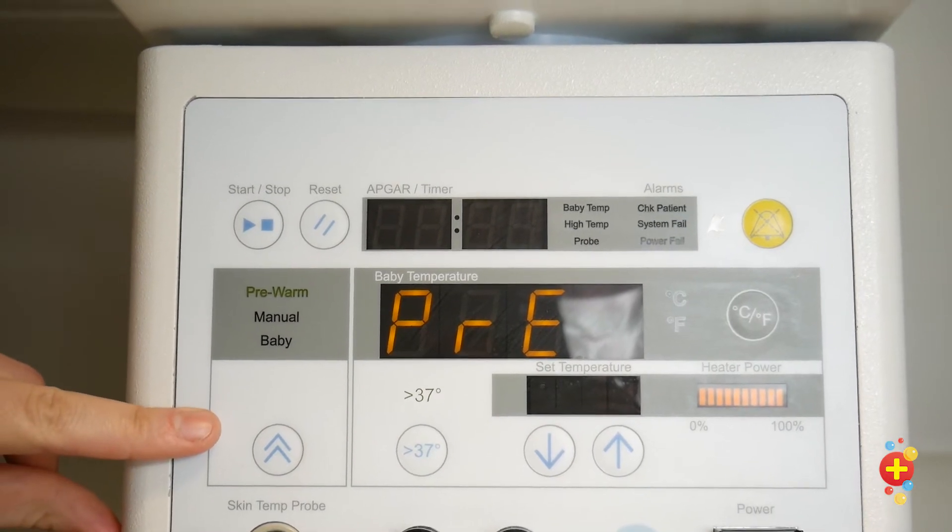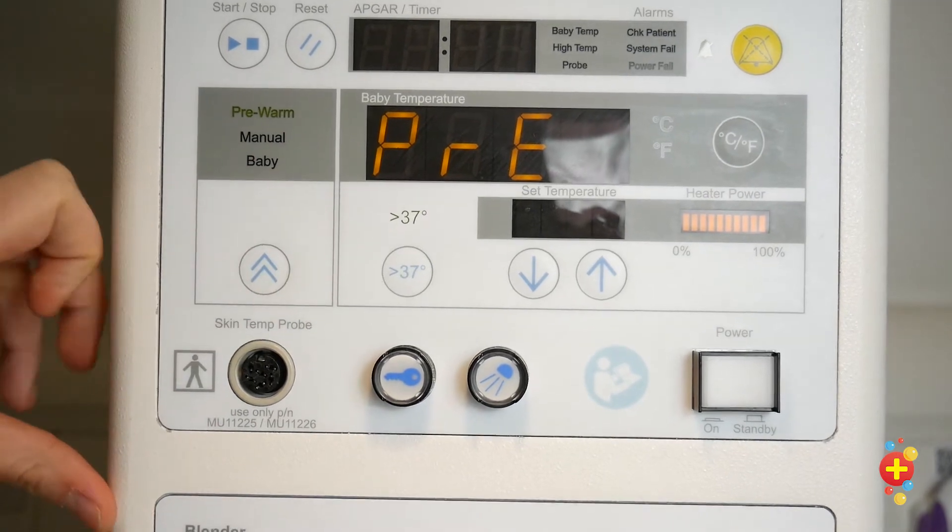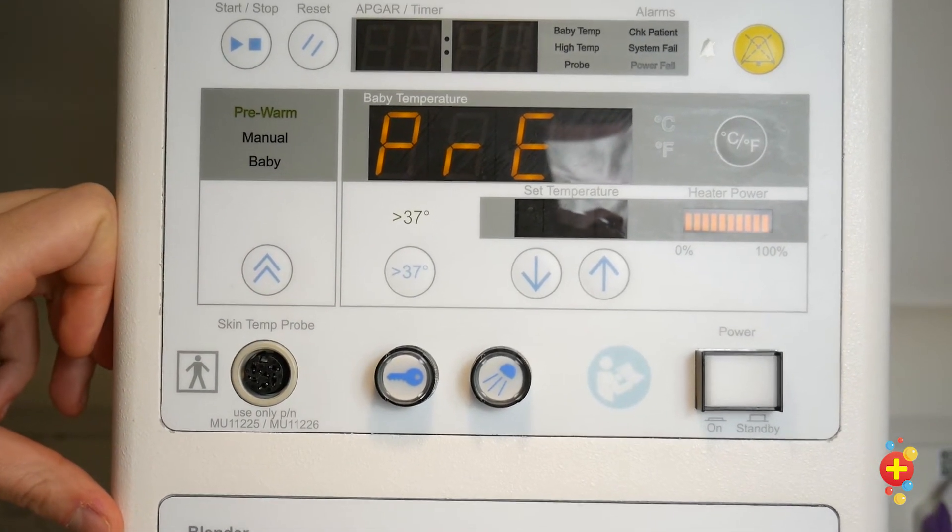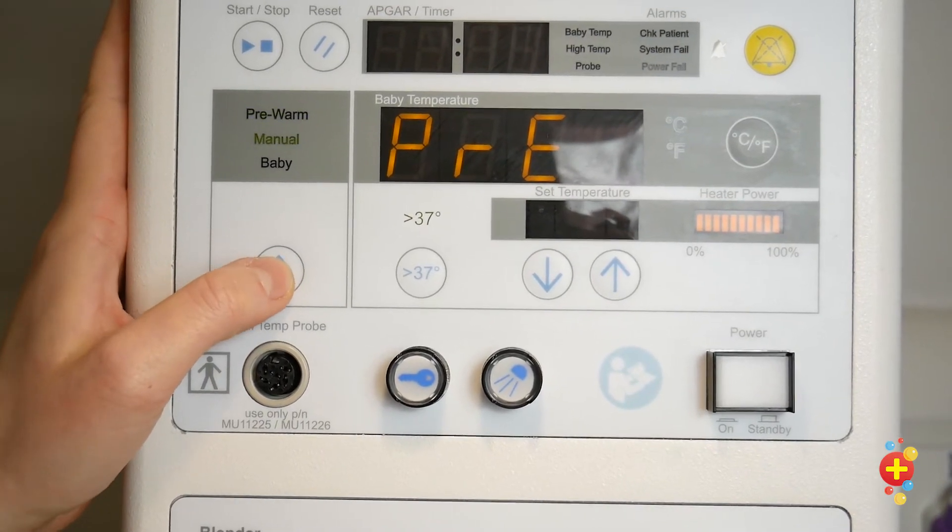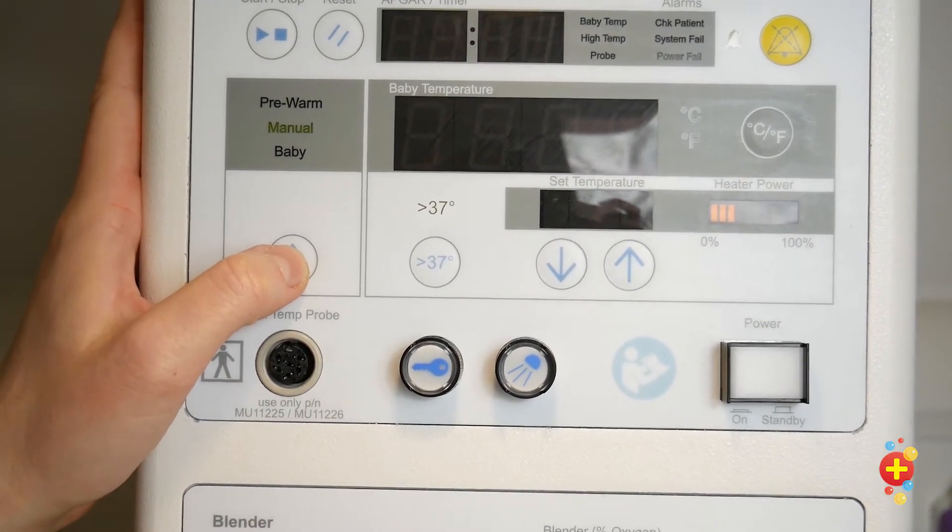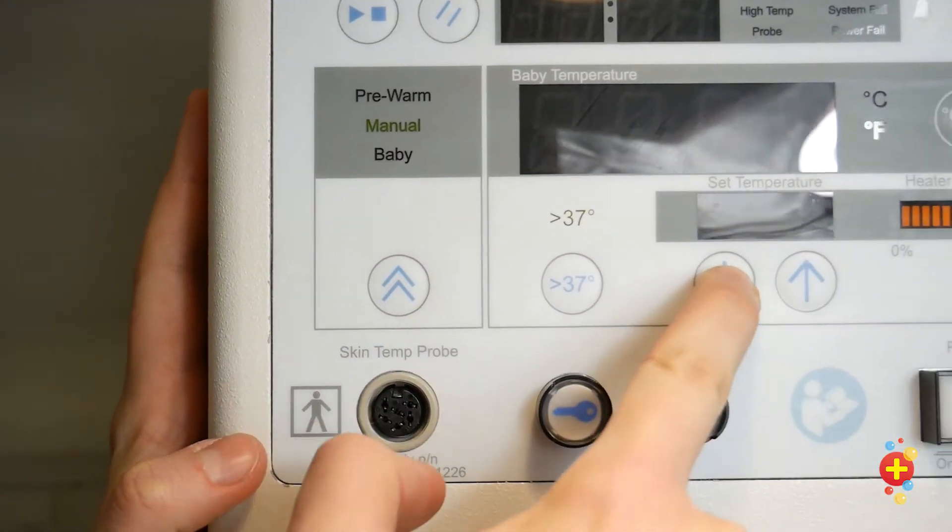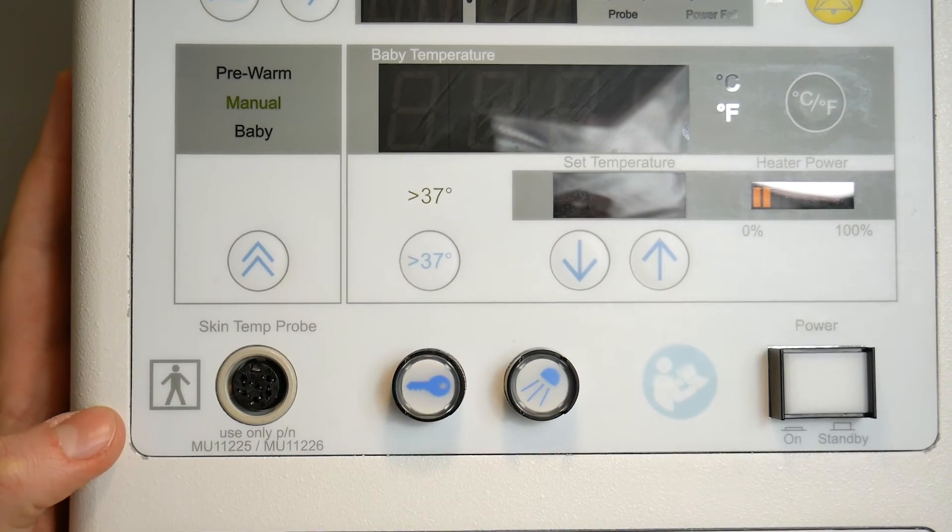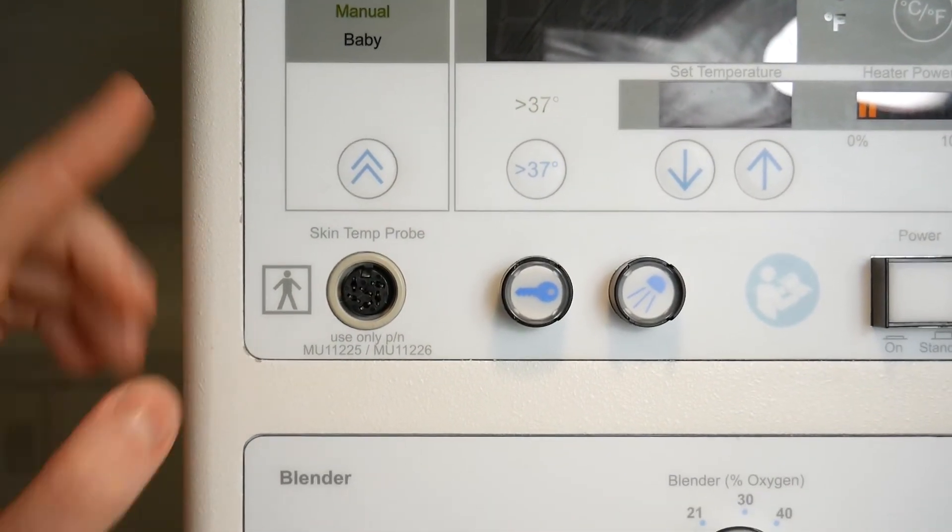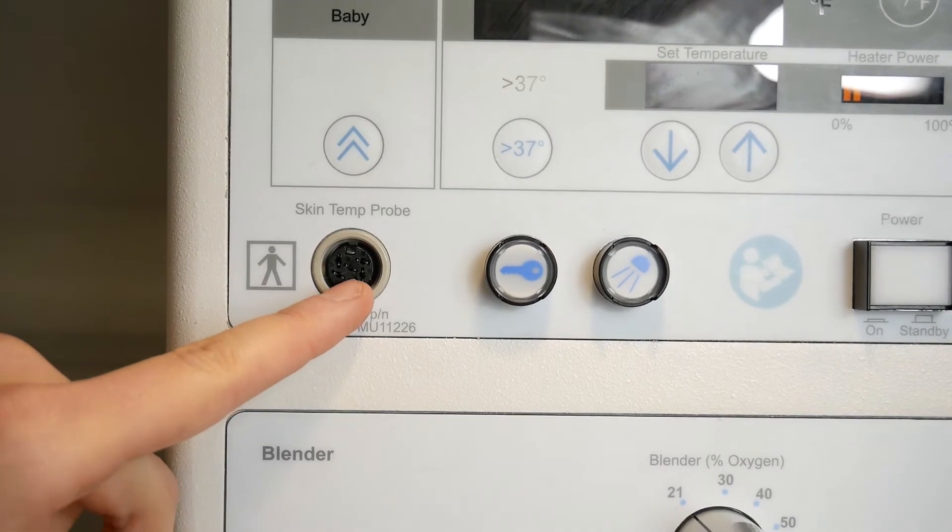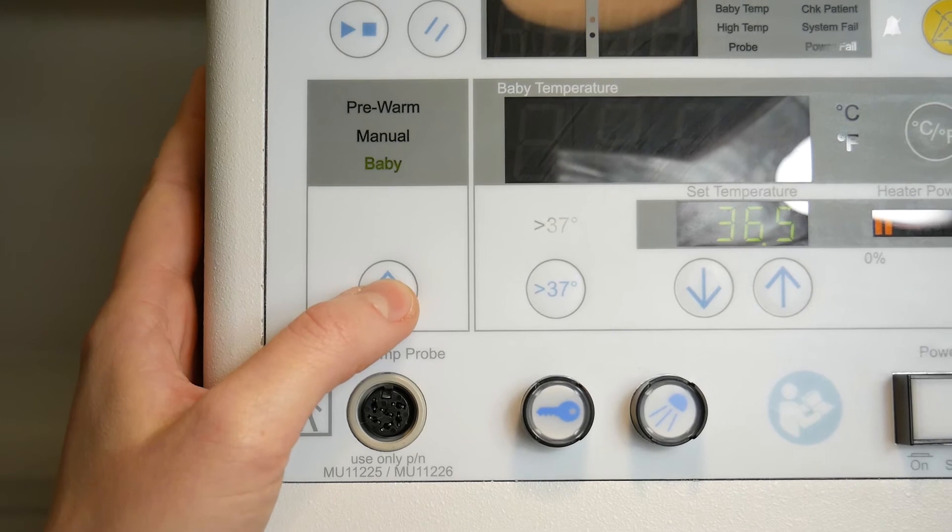Moving down we have the temperature settings. The machine will automatically turn itself to pre-warm, but say for example you want to increase the temperature of the machine in a hurry, use this button to switch it to manual. You can then dial up the temperature with these buttons here. If you're using a temperature probe to continuously monitor the baby, attach it here. You just need to remember to set the settings here from pre-warm or manual to baby.